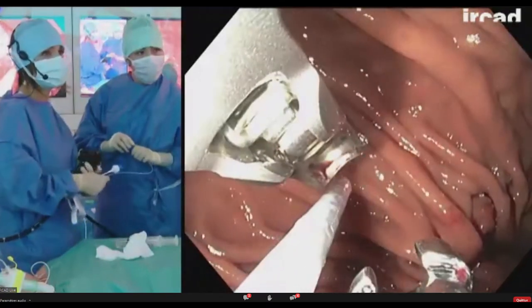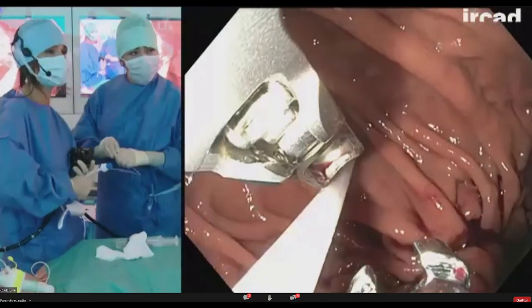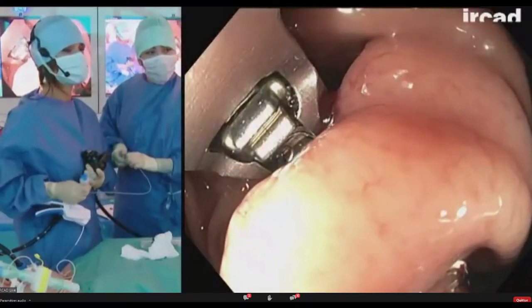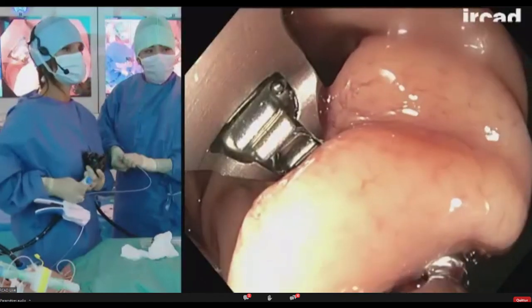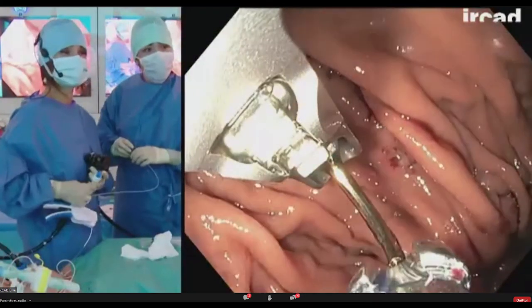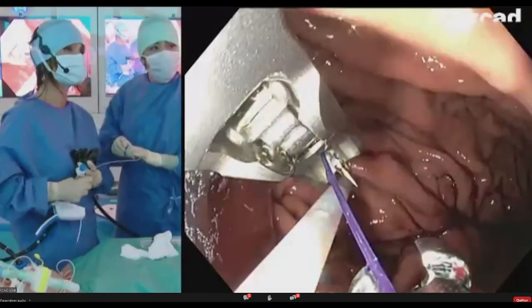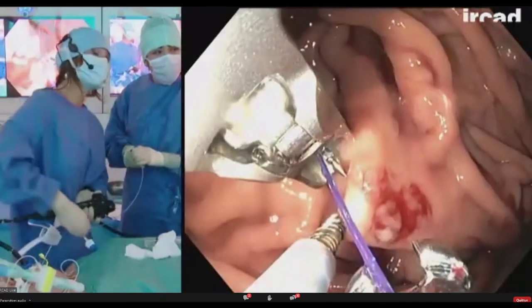Yeah, we do, but we have been doing it so far since we're doing endoscopy anyway at 6 months and 1 year. If at the 6 month endoscopy the patient hasn't reached a BMI below 30, we do offer resuturing if and only if the patient was compliant with the dietary support and follow up. If the patient was not, so here it was my fault, I was distracted. So we do resuture, but only if the patient is compliant. If the patient was lost to follow up, or is not coming to see us in the office, or if the BMI is below 30, we don't resuture.